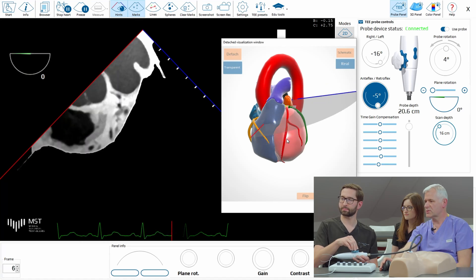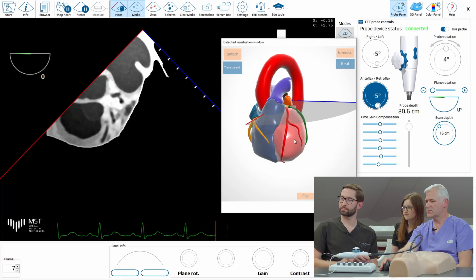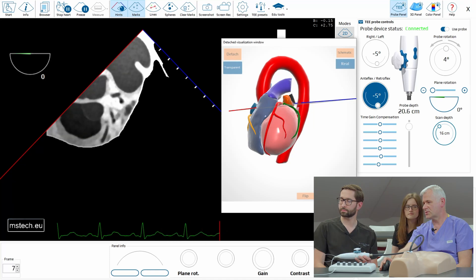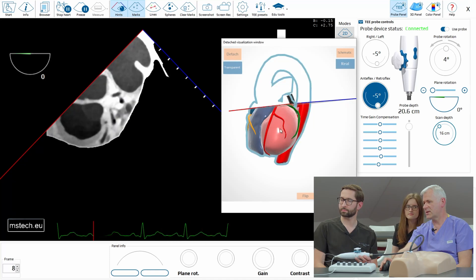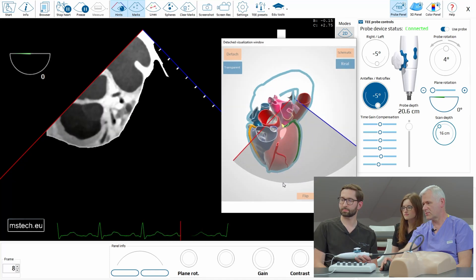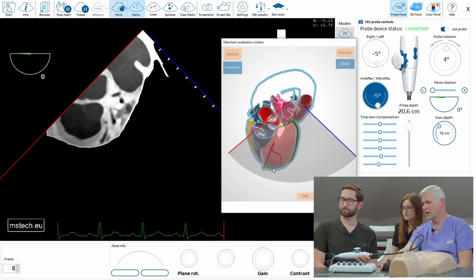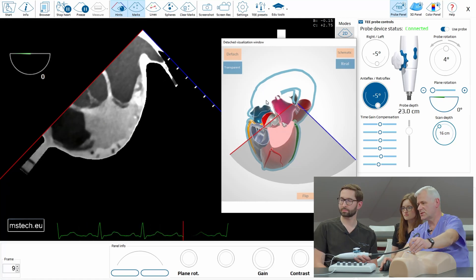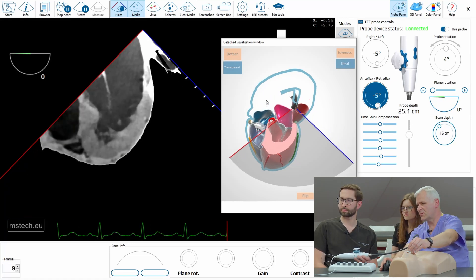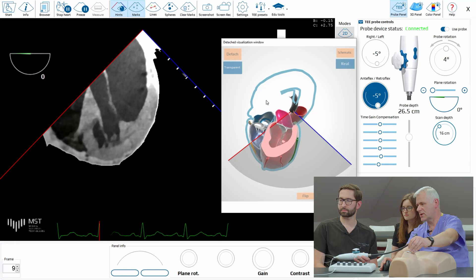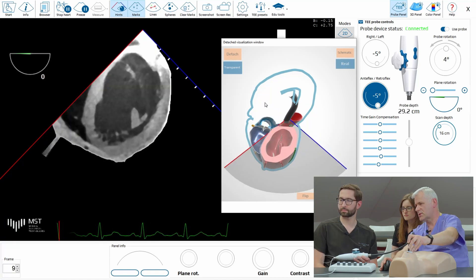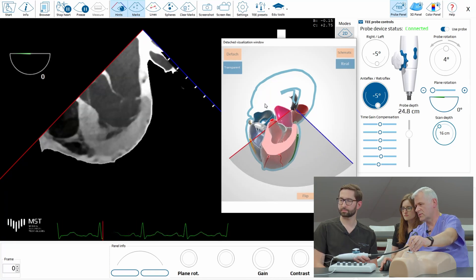So having those manipulations we'll have to perform the study. This model lets you also see the inner part of the model. Once you insert it, you see different levels with different anatomical structures from the bottom to the top, or in reverse.